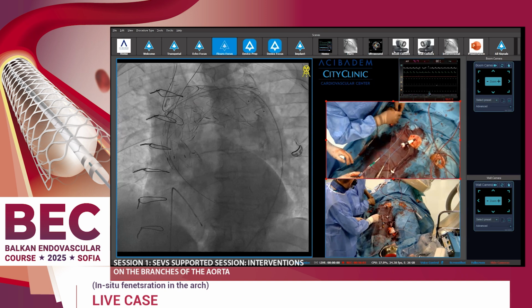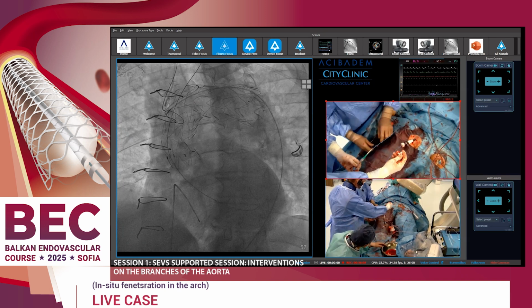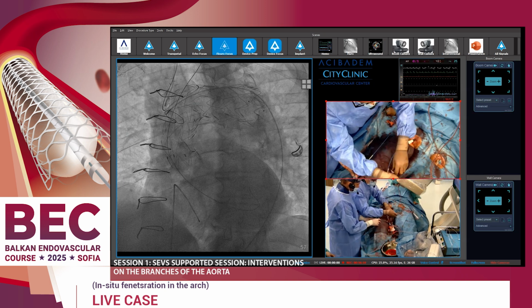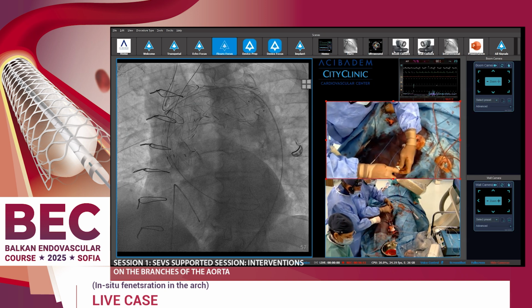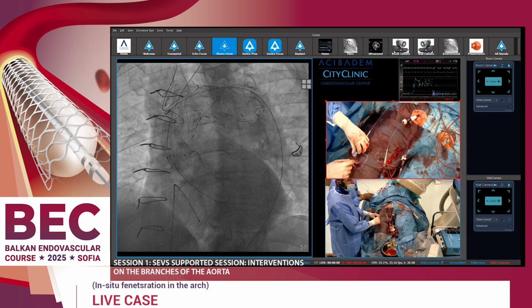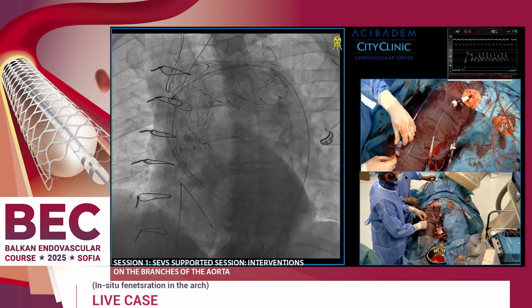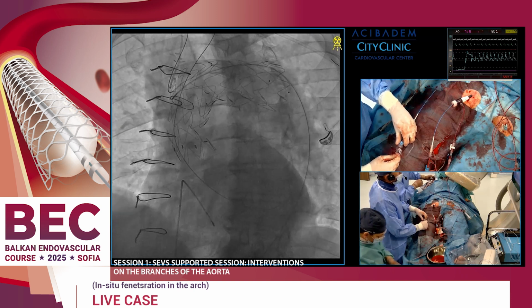Let me see, we have lost both. We can put here. Yeah. The pressure, I want to see. Excellent. Okay. Hemodynamic control. Let me see.